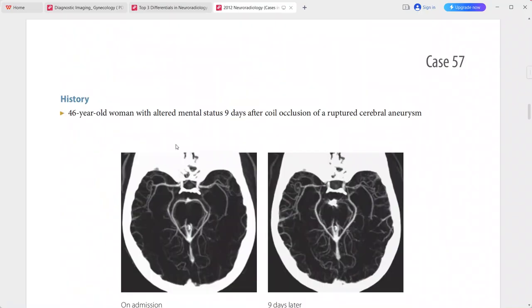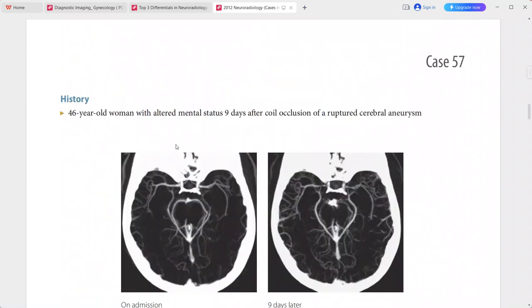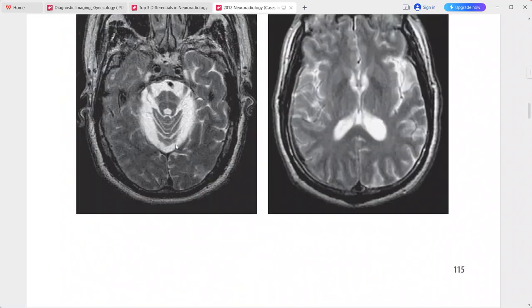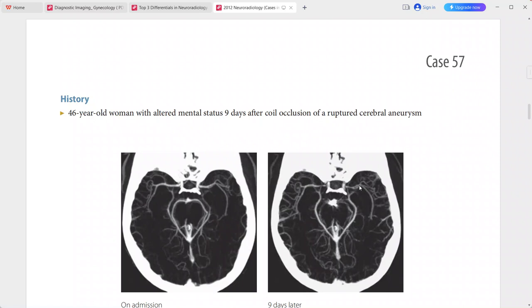Next: a 46-year-old woman, 9 days after coil occlusion of a ruptured cerebral aneurysm, presenting with altered mental status. CT angiogram MIP image from day 9 shows multiple areas of narrowing in the proximal middle cerebral arteries bilaterally, compared to the admission MIP image.